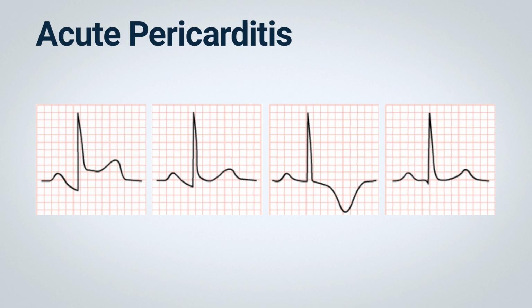The resemblance between the ECG patterns of acute pericarditis and acute MI, especially with both conditions possibly leading to ST segment elevations followed by T wave inversions, warrants emphasis. It's worth noting, though, that pericarditis-induced STT changes are usually more diffuse compared to the localized changes associated with MI. Another distinguishing factor is that pericarditis does not lead to abnormal Q waves, as is the case with certain infarcts.